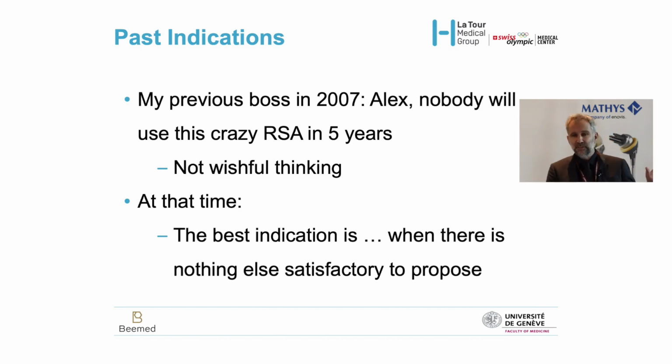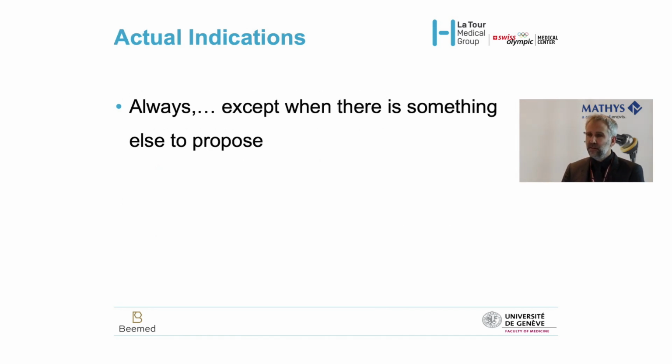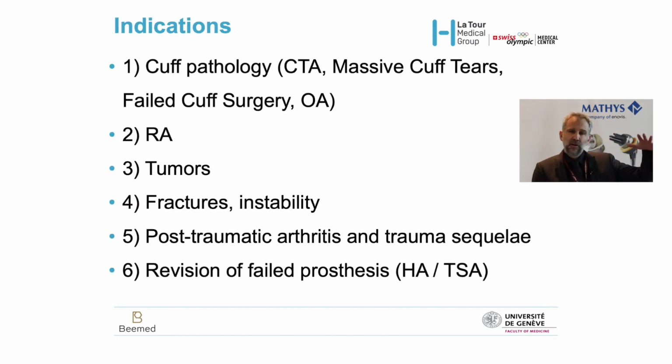So in 2007, when I was starting a presentation and talking about indication, the best indication for prosthesis was when there was nothing else to propose to the patient, okay? And today, this is my indication. It's always, except maybe if there is something else to propose to the patient. So you all know this list of surgical indication. And honestly, the reverse has changed our life.